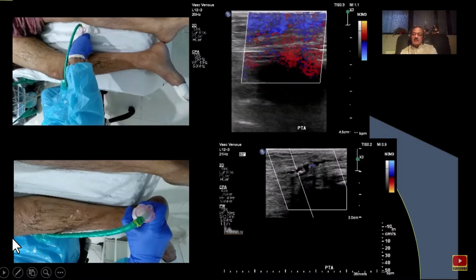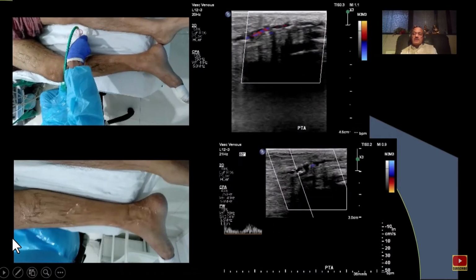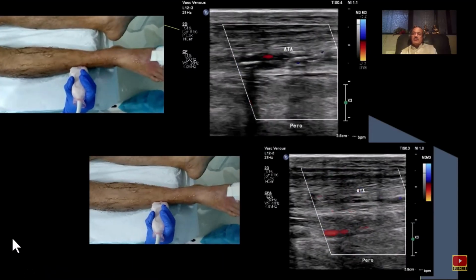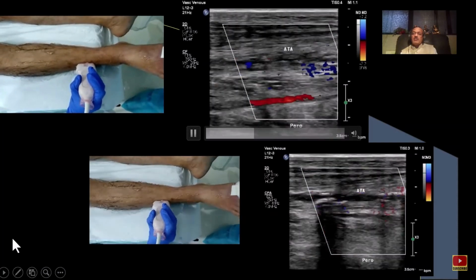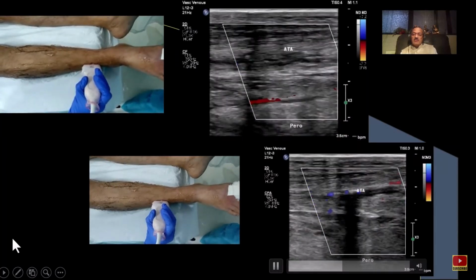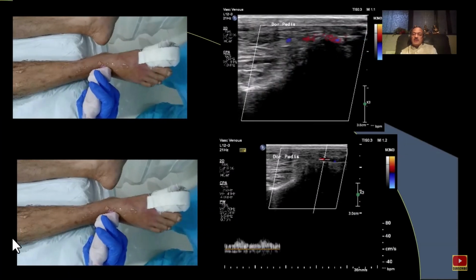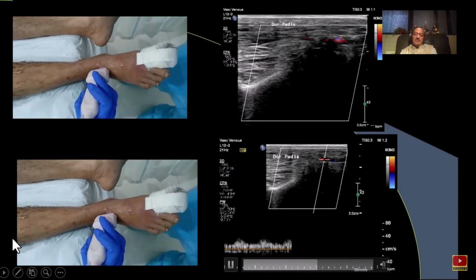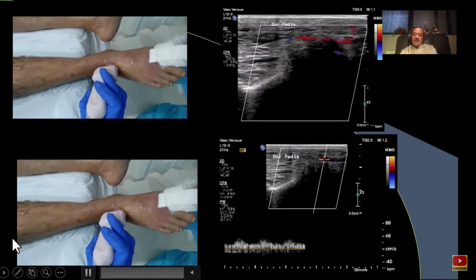Telling us that this blood has come through a severely atherosclerotic stenosis, and that's what we saw approximately. And we traced it right up to the end. The anterior tibial artery shows that parts of the anterior tibial artery are occluded. There are some collaterals there, and we can trace it right up to the foot. And when we look at the dorsalis pedis again, we can see some flow, but the flow is dampened monophasic or tardus parvus, and that's the patient who had gangrene.